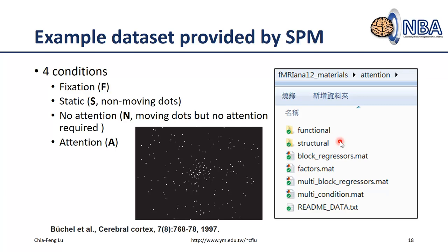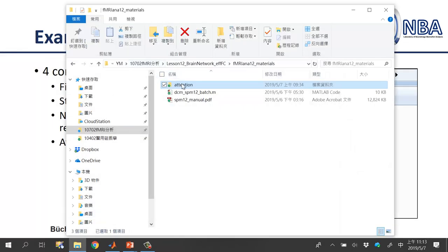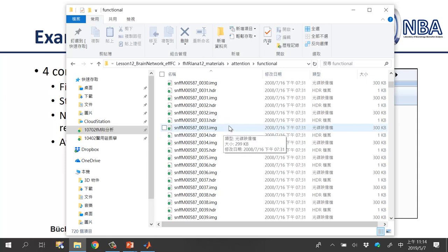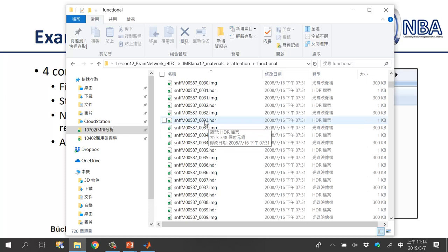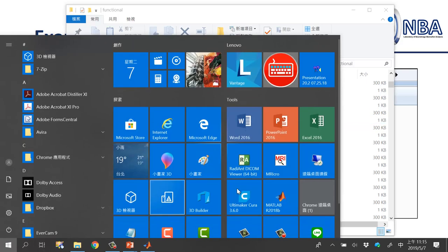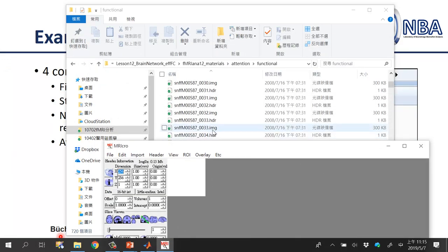Let me introduce the structure of this dataset. In the attention subfolder, you can see there is one functional subfolder and one structural subfolder. The data is actually stored in the Analyze 7.5 format, so you will have a pair of files — for example, for file 0033 you will have an HDR file and an IMG file. This is a pair for one FMI file. You can use MRIcro to view what the data looks like.